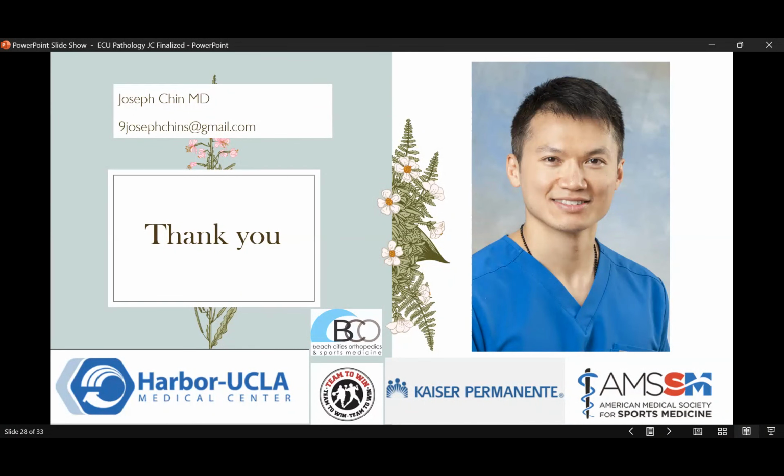And so the subsheath you can make more conspicuous by just gently rotating, pronation and supination. By gently pronating and supinating, you'll see the subsheath that is under the retinaculum. So that's important. When I see an intact subsheath, then I know that if there is instability, it's probably due to laxity and not a tear of the subsheath that arises for ECU instability.